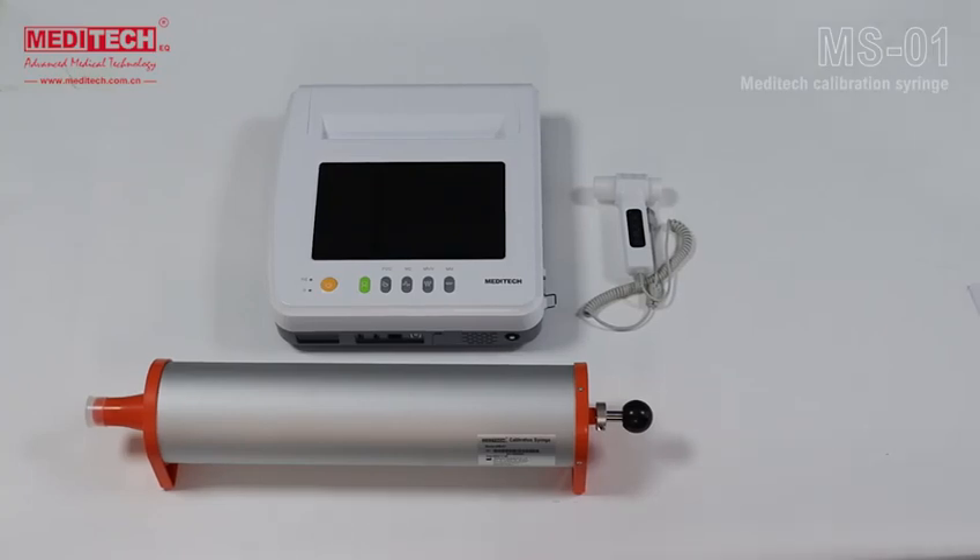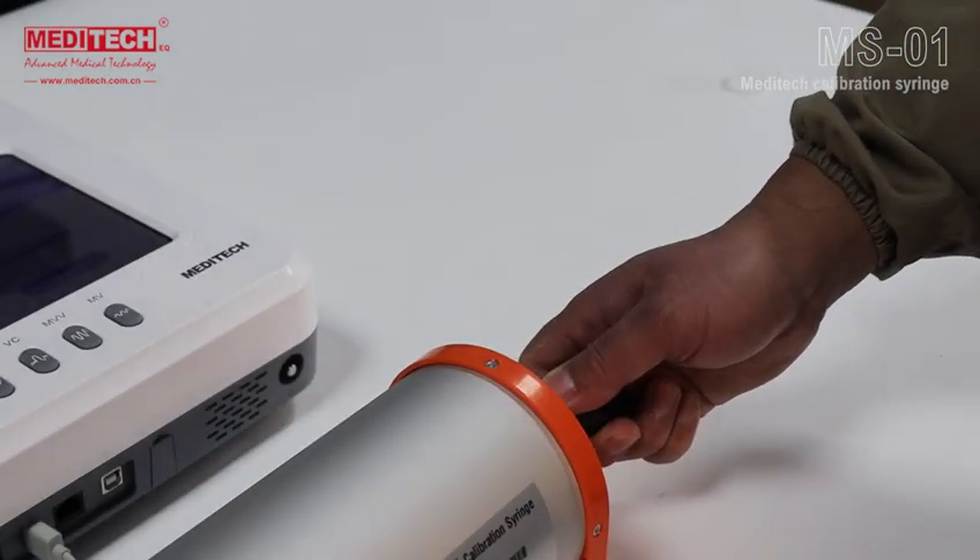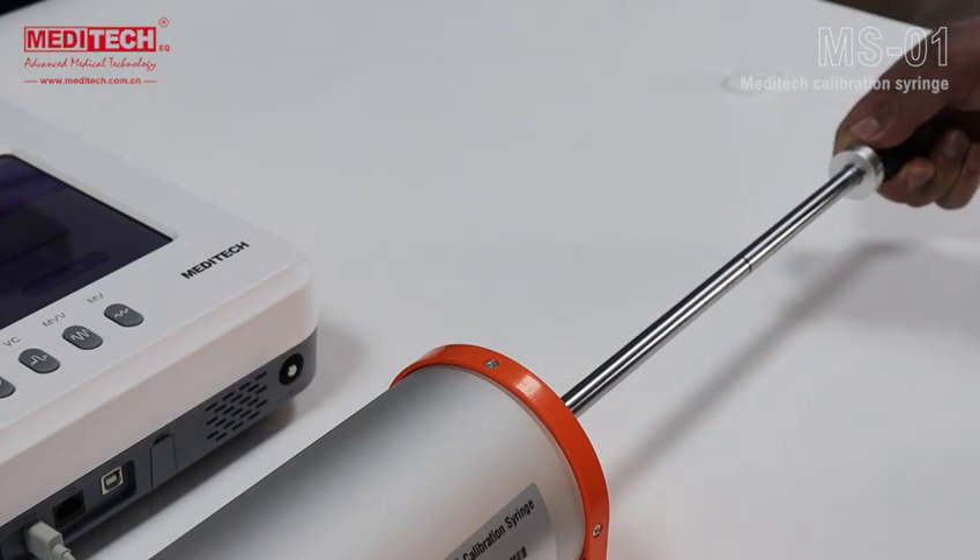The calibration syringe is used for the calibration of pulmonary function tests or spirometry. The maximum calibration capacity of the Meditech calibration syringe MS-01 is 3 liters, but it can also be set for a 2-liter calibration test.